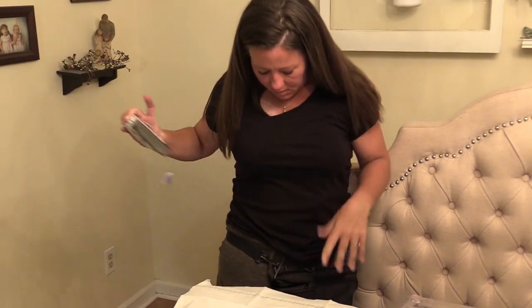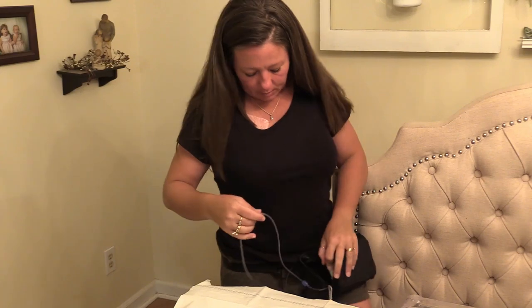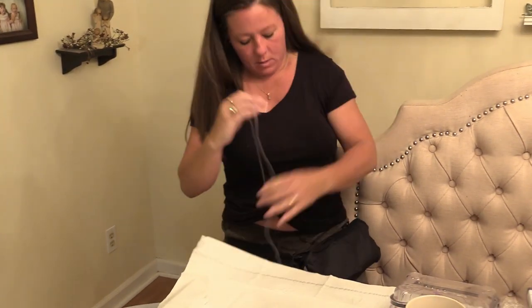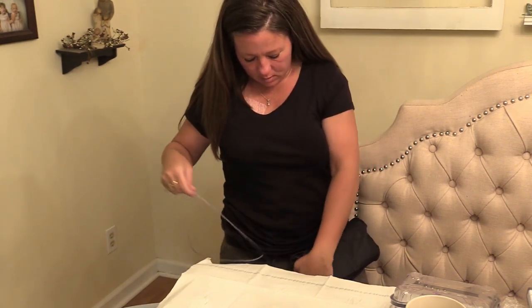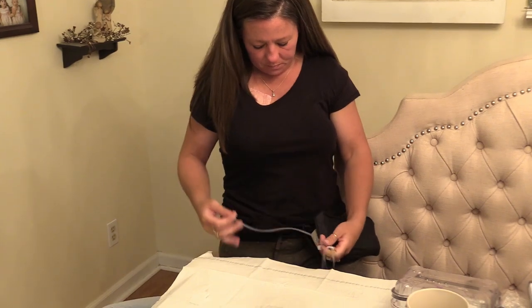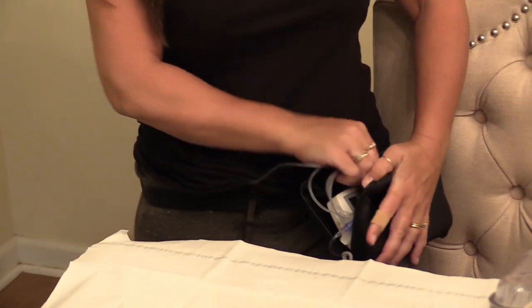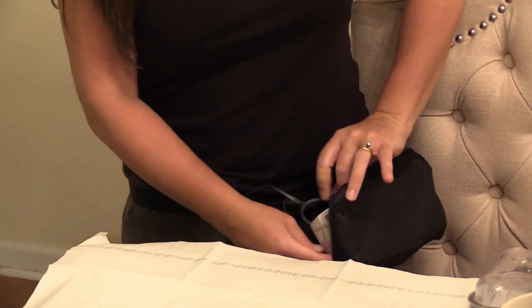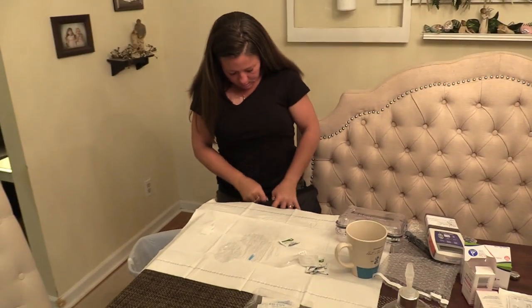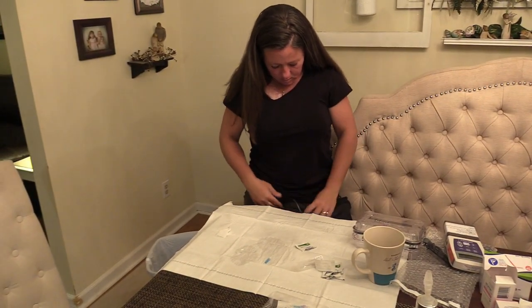Now I can put it in — I ran the line under my shirt. Then I just coil this up, round it up, and we're good to go.